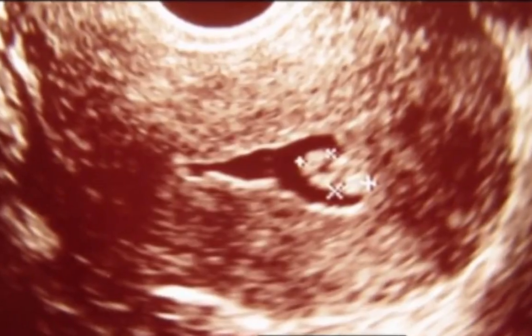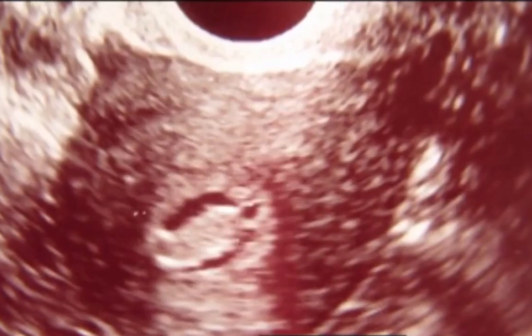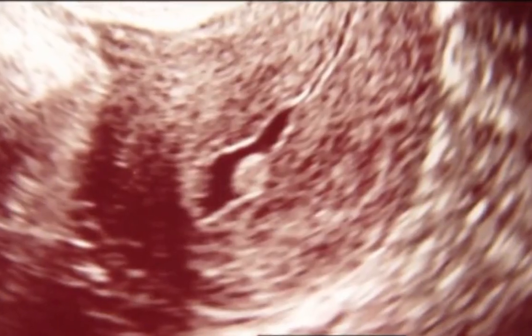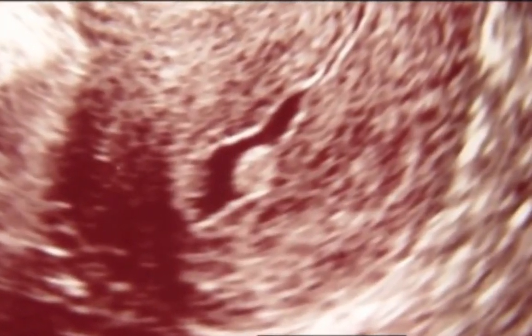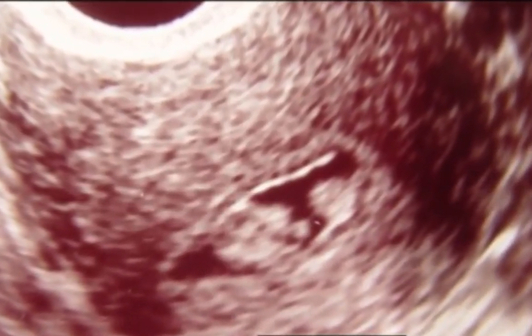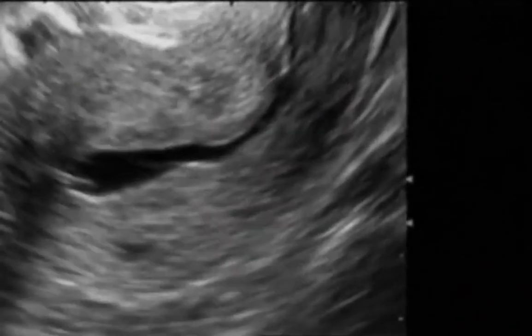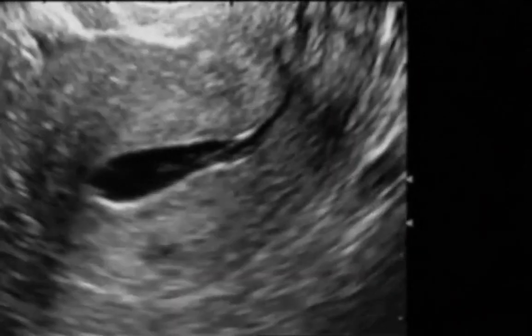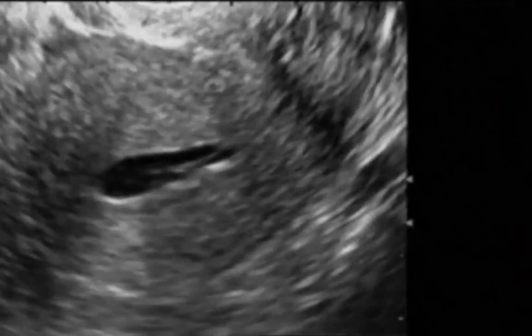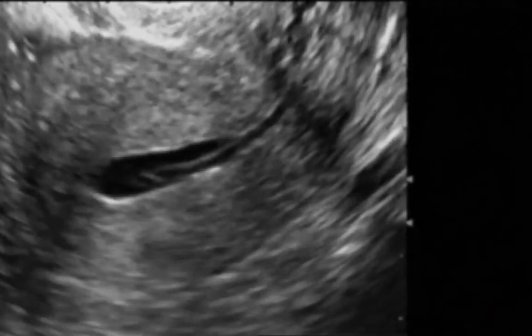Polyps may come in different sizes, location, texture, and numbers. At times, it may be difficult to distinguish them from pedunculated submucous fibroids. That distinction is not usually important since they are both benign and the treatment is the same. This sonohysterogram was performed using a straight pediatric feeding cannula and 10 cc's of sterile saline. The fluid leaks out through the cervix and fallopian tubes, but the leak is slow enough to allow good visualization of the cavity.